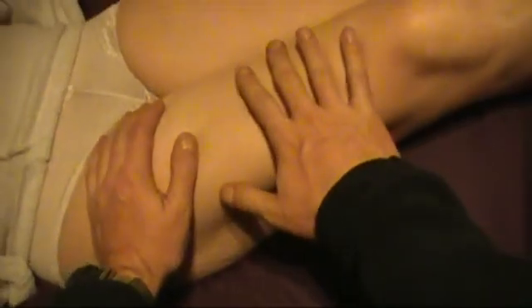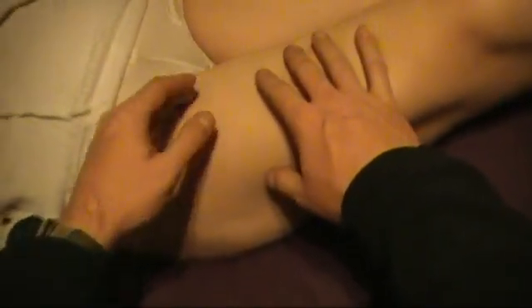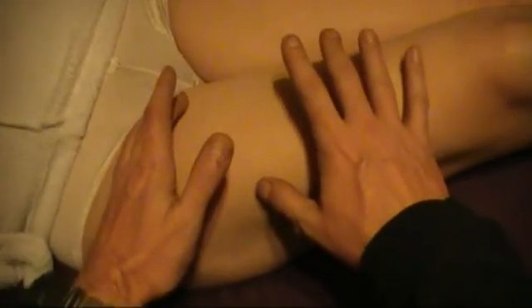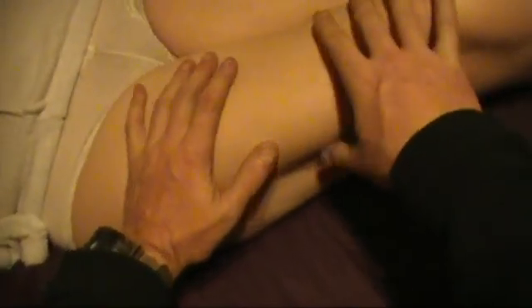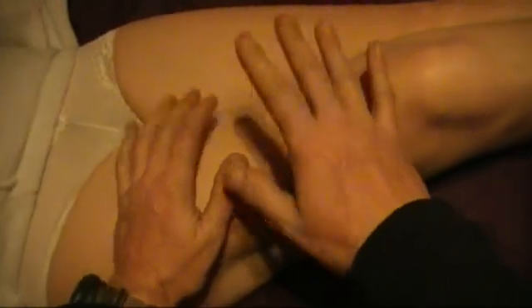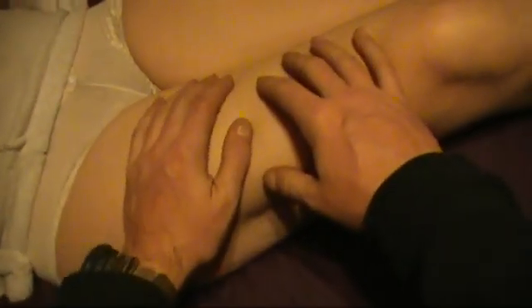Tourniquets are only to be used on limbs. If you had an arterial bleed up here in the pelvic region, you can't put a tourniquet here because you can't tourniquet up this high. That's for different hemostatic agents, and we'll get into that in a different video. Right now, we're just going to stick with the basics of an uncontrollable arterial bleed in a lower extremity, and basically how to apply a tourniquet.